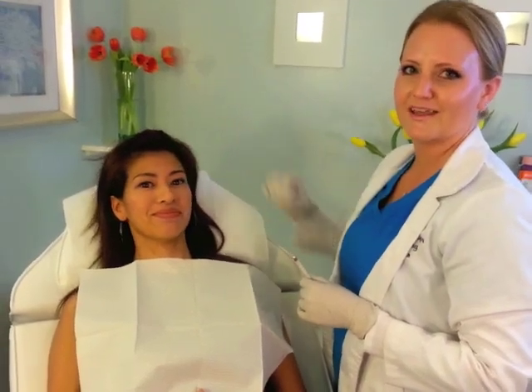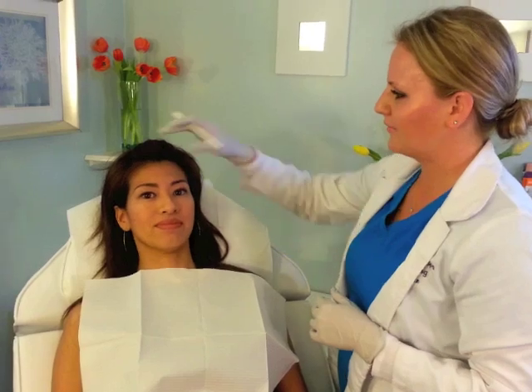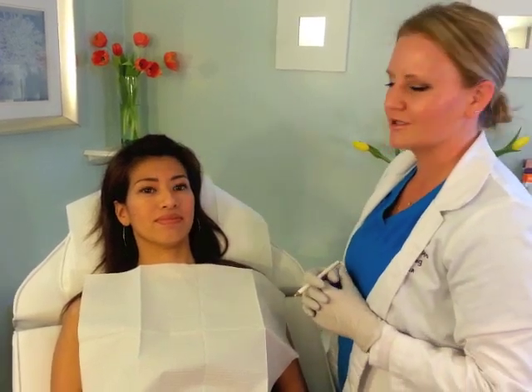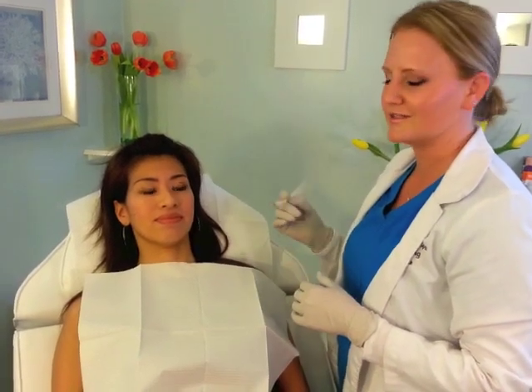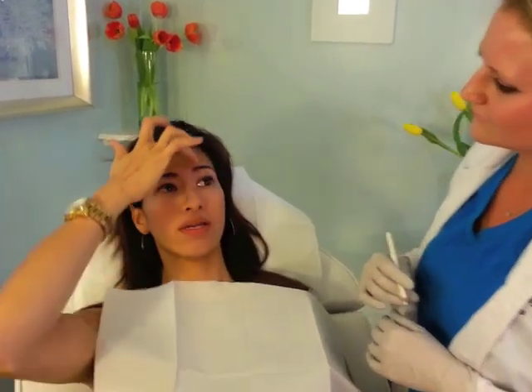We have just prepped the skin for injections of botulinum toxin A, and my lovely client here is going to tell me a little bit of what she's concerned about and what she's trying to treat today. When she makes this expression, that line right here between the eyebrows is building up a crease, and there's another one just slightly above the forehead that she'd like to get taken care of.